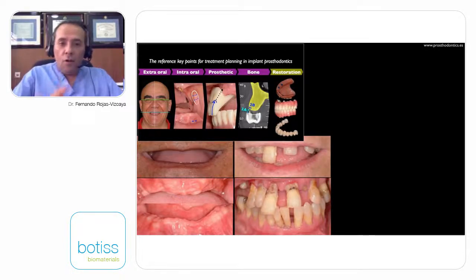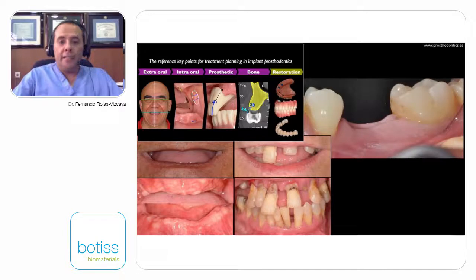But all this sequence I need in a complex situation. To explain the 3A-2B rule, let me present two cases. One very simple and very predictable because we have the bone in a correct position. This is the molar that we need to restore, and this is the case that with or without analysis we can obtain the same outcome.